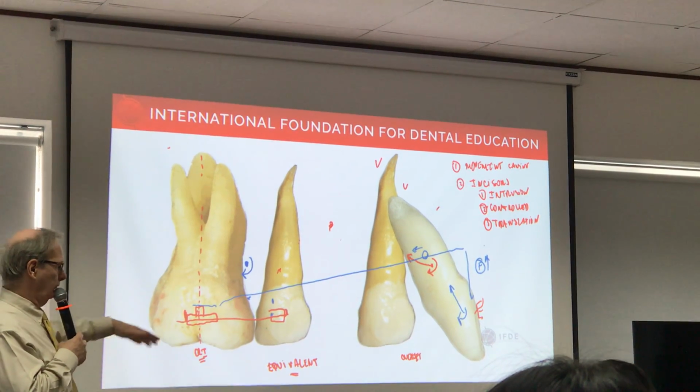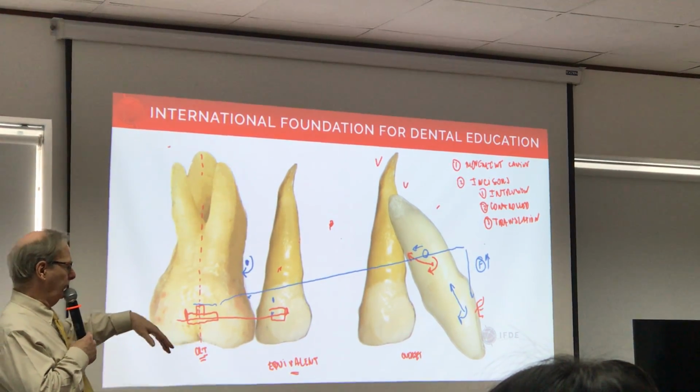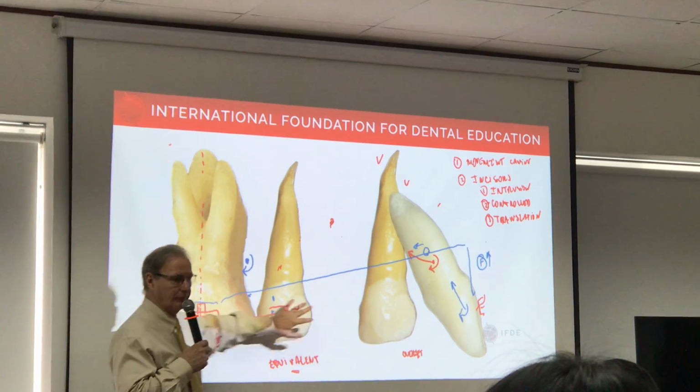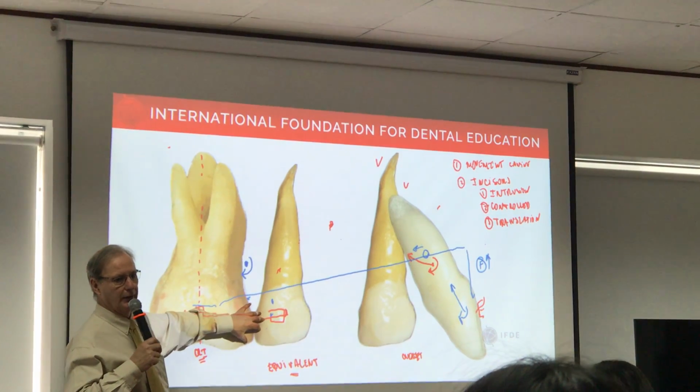And again, we'll talk about probably microimplants next time, but this is it depends. If you want 100% retraction, you have to lock this. There is no way. Okay?